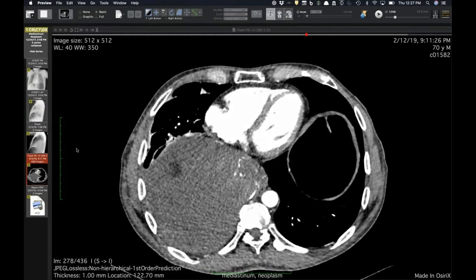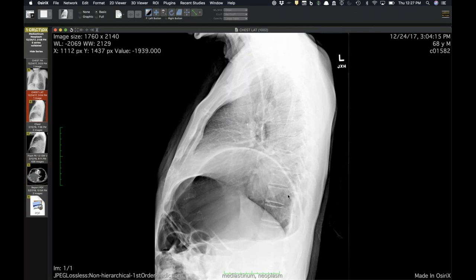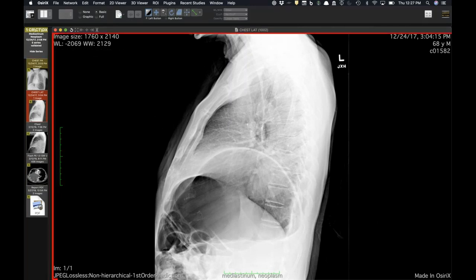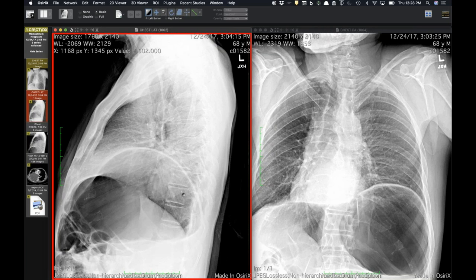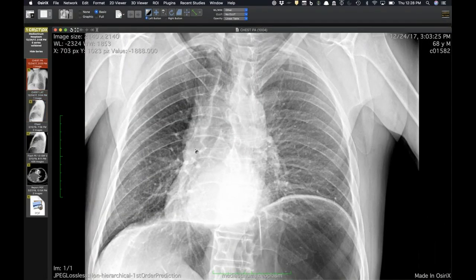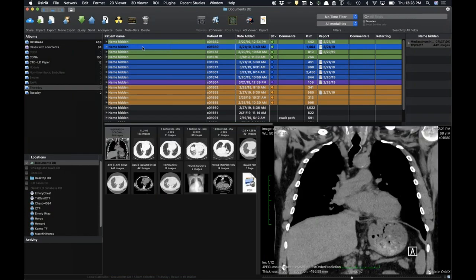Wow. I think the radiograph findings on both the PA and lateral view, hopefully someone might make that diagnosis prospectively. But you've got the confounding factor of this massively distended colon causing distraction - somebody might think it's just a tortuous aorta, although you can see the aorta here and it shouldn't sweep that far anteriorly.